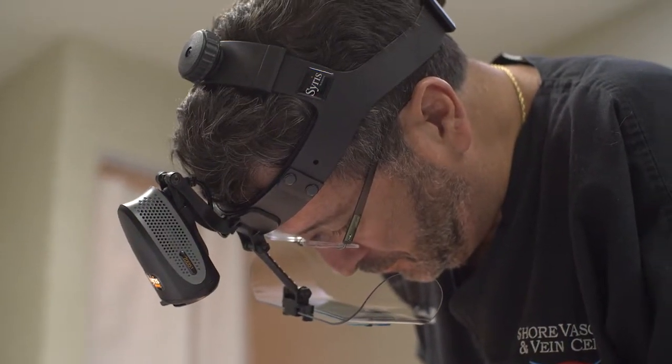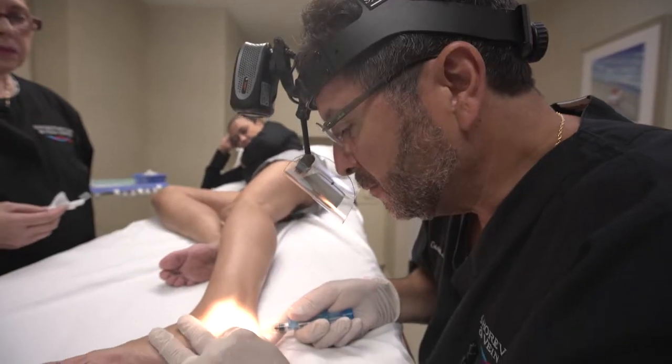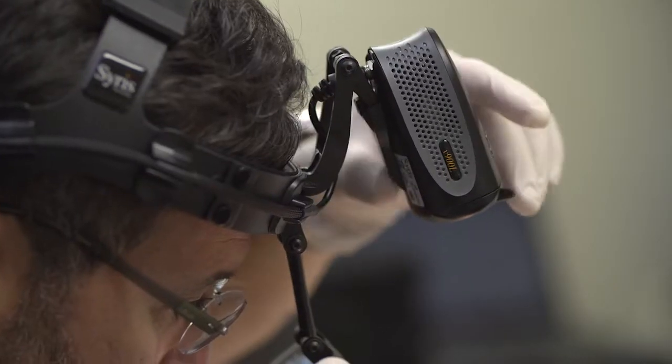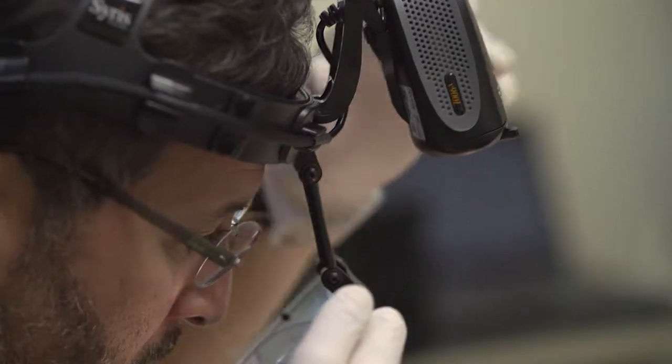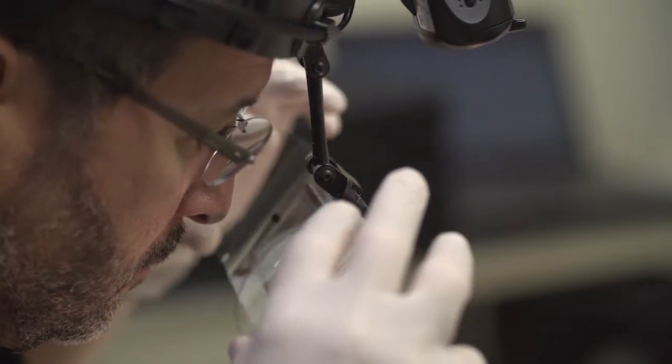The Syris V900 light is my most essential tool in performing sclerotherapy. More than half the battle with the procedure is being able to see properly what you're doing, and the Syris light really allows you to see properly how to treat these spider veins, and the results are infinitely better.